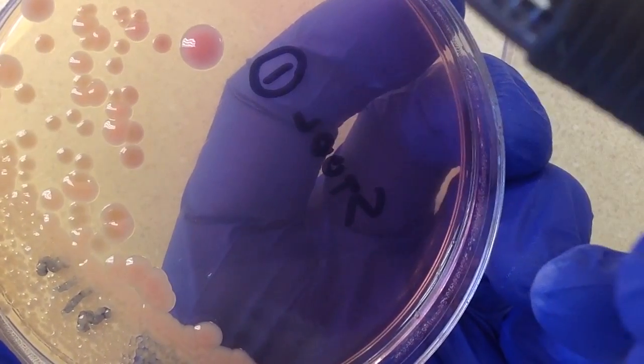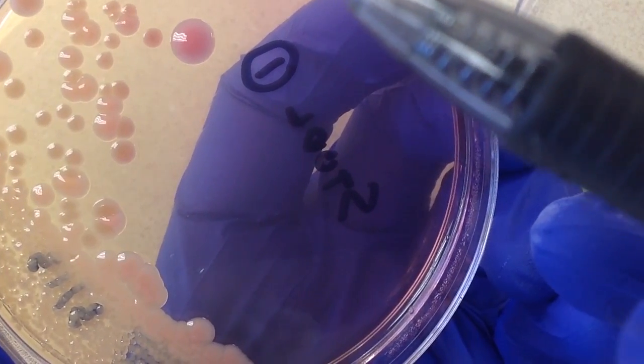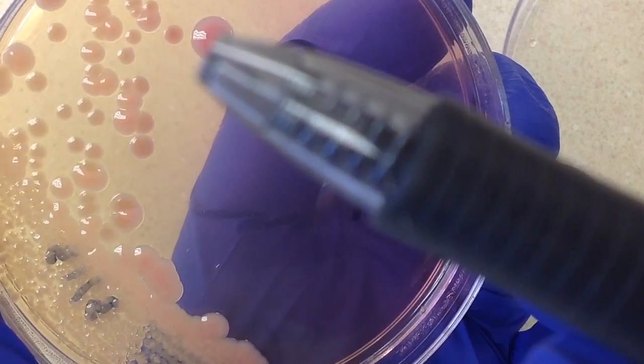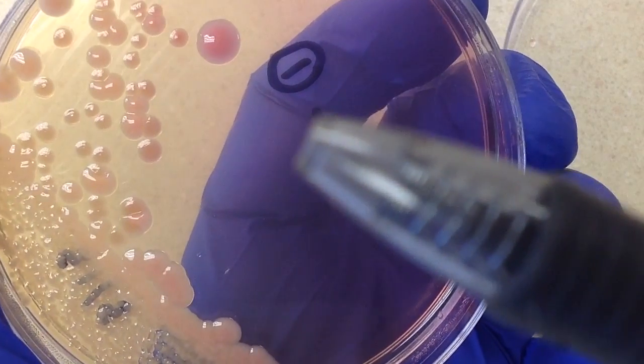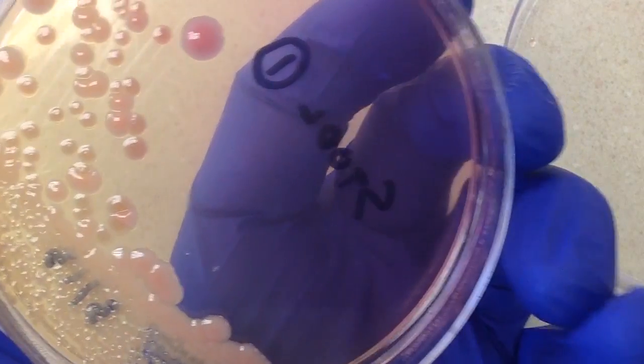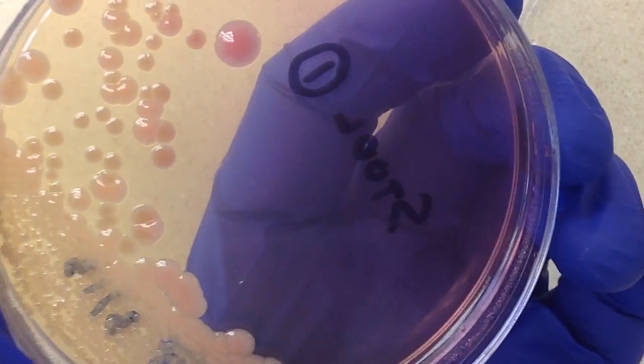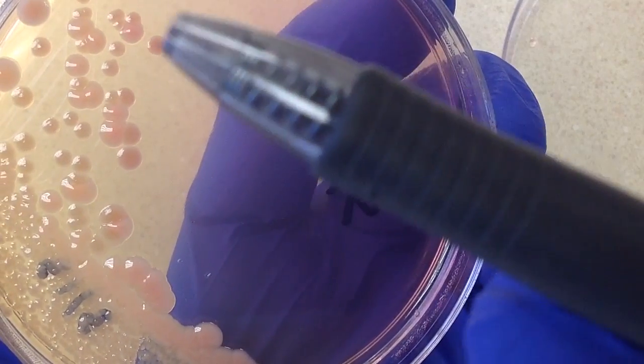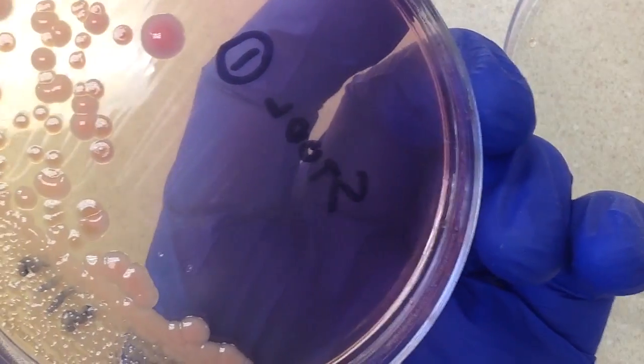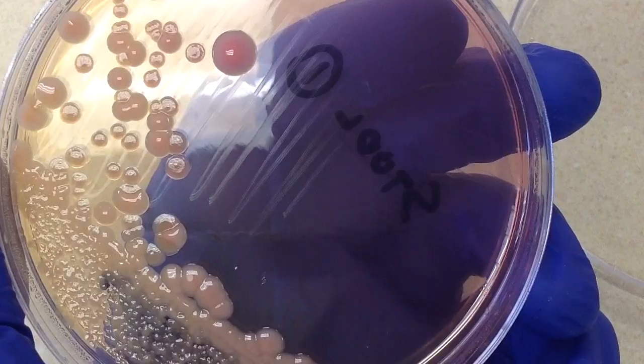These ones are clearly pink, and I feel very comfortable calling those lactose positive. Behind here we have some different looking colonies. Generally on plates like McConkey's, the longer they're on the plate, if they were pink, they start to revert back to being lighter in color. But for me, these ones back here are pink as well.